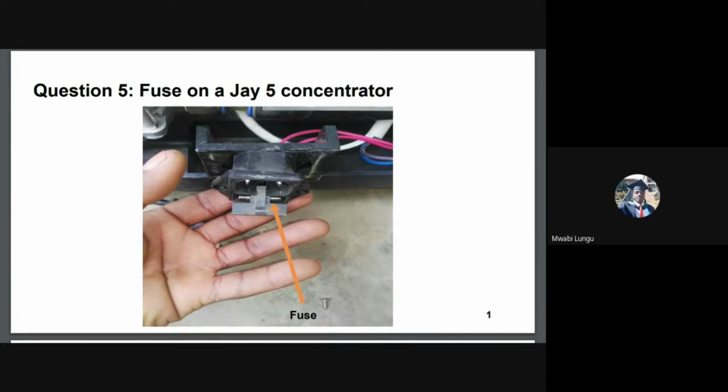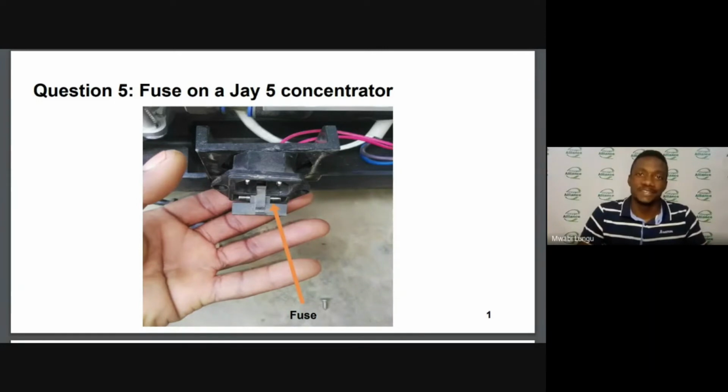Thank you very much, Francis, for that explanation. I hope that was clear enough. But if we have some questions or comments, we are free to add on to that. I have to admit that it took me time to realize that you have a fuse under the power, where you connect the power cable. So it might give you a headache if you are not sure of where to find it. So thank you very much, Francis, for that answer.